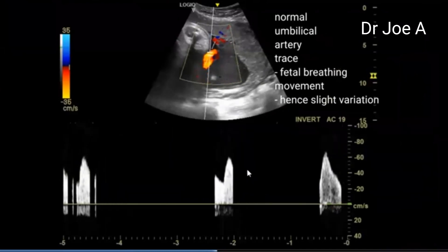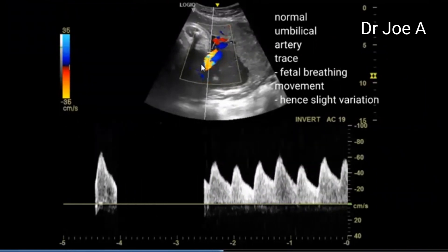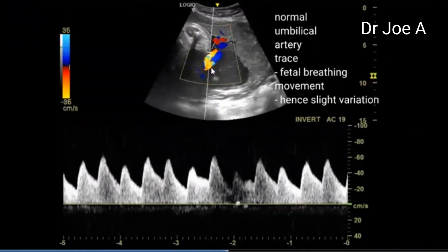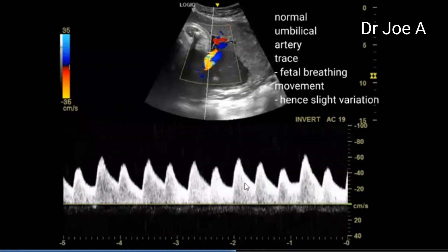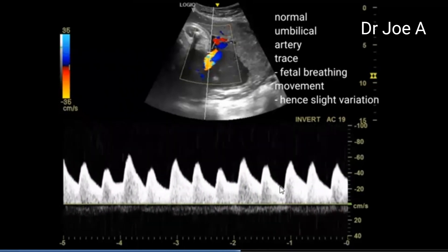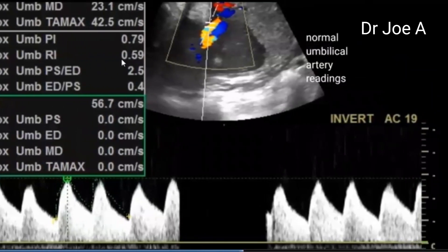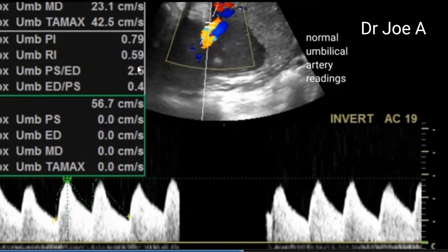Now you can see the umbilical artery. We're trying to get a good umbilical artery pickup, waiting to get the sample gate correct over the umbilical artery. The umbilical artery shows a good waveform, but you can see alternating high and low peaks — this is due to fetal respiratory movements. Respiratory movements can cause variation in the systolic peak of the umbilical artery. The RI in the umbilical artery is 0.59.